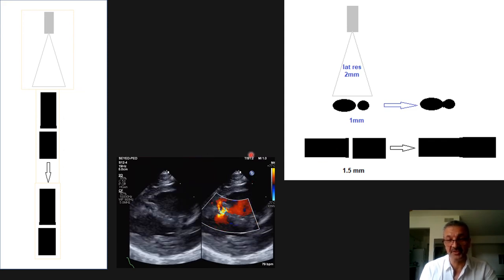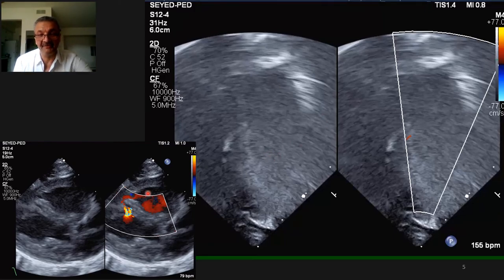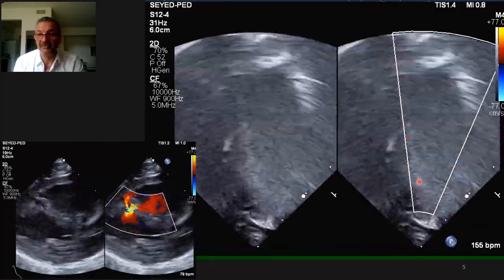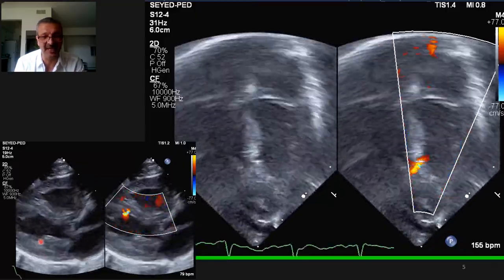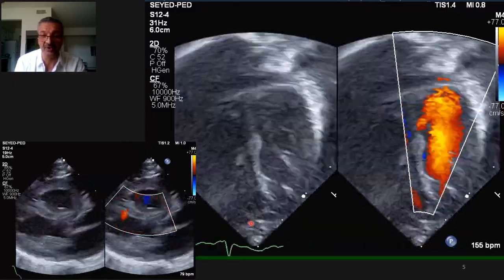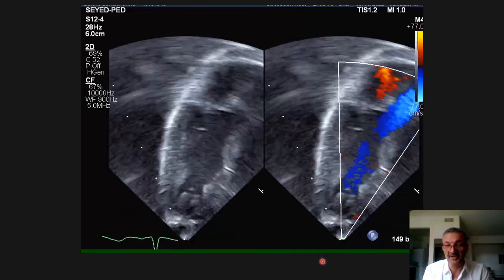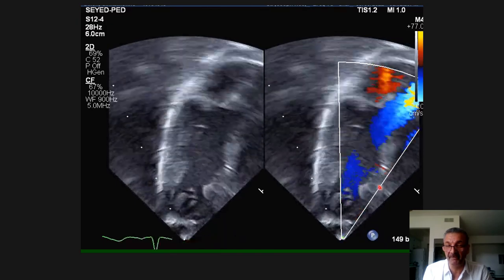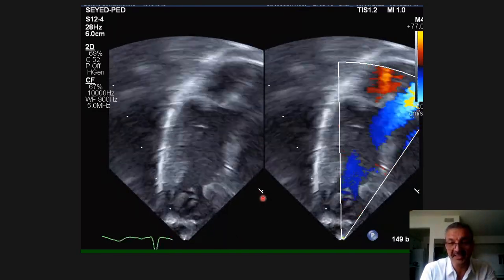Based on this, the best view for answering that original question is the apical window. And indeed, in the apical 4- or 5-chamber view, you can see the defect very clearly compared to the parasternal view where you can barely see it. In apical 4 or 5, or apical 3, you can clearly see the defect, pause, and measure the diameter easily, because the two borders line up perpendicular to the sound wave and the machine uses axial resolution.